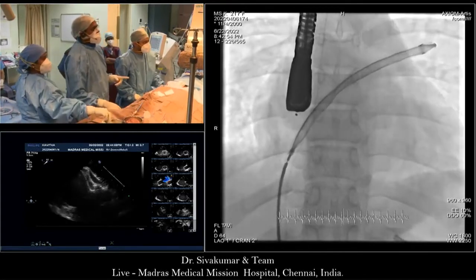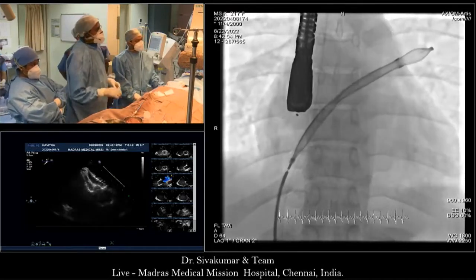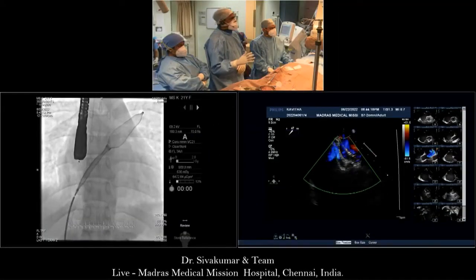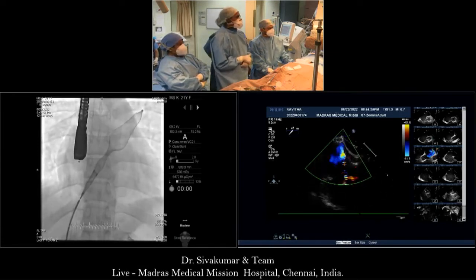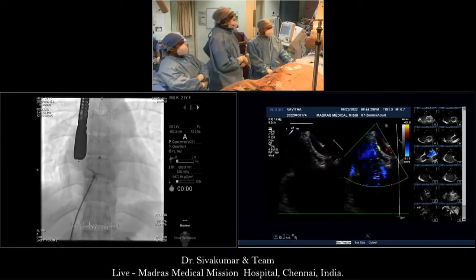If I leave it, it will embolize. I would take it out already. No, color it. This sort of undersizing is very risky, and these are all recipes for disaster. Correct. Show Zaid the mitral valve before you ask. Absolutely, that's an absolute contraindication.